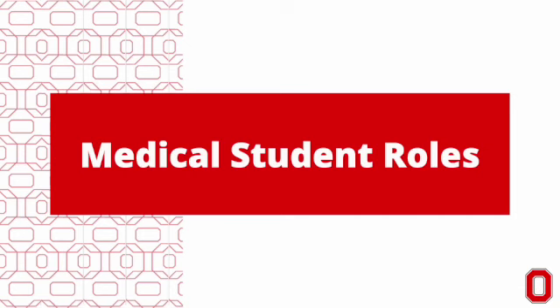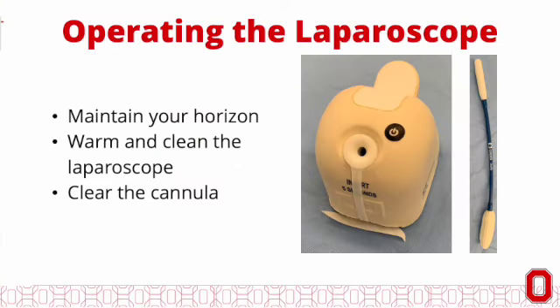We will conclude with a discussion on common medical student roles during laparoscopic surgery, namely, operating the laparoscope and closing the port sites. As medical students tend to take more of an active role in laparoscopic cases, it is essential to familiarize yourselves with the basic procedural steps for any laparoscopic case. The surgeon will map out the port placements on the patient's abdomen after correctly positioning and sterile preparation of the patient. After installing all of the ports, the surgery can then proceed.